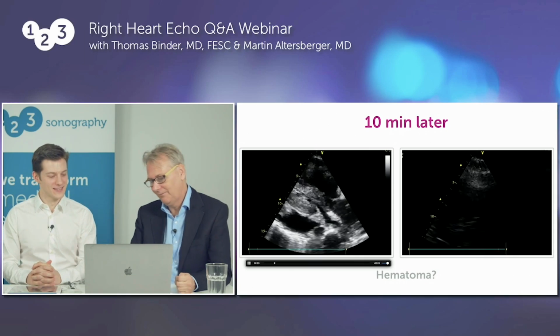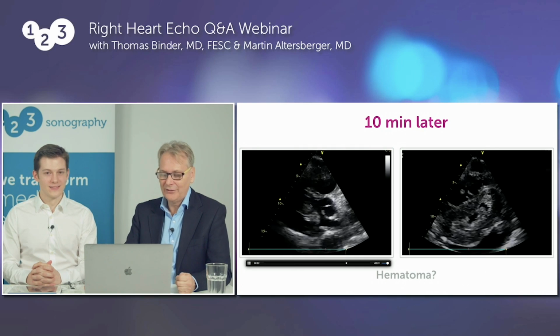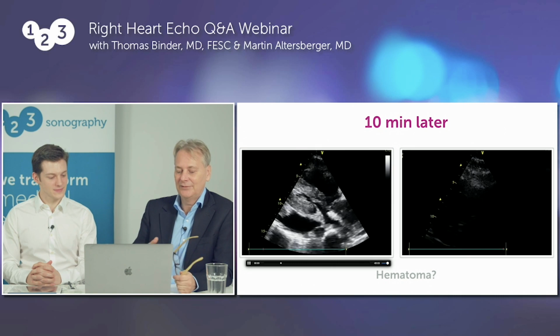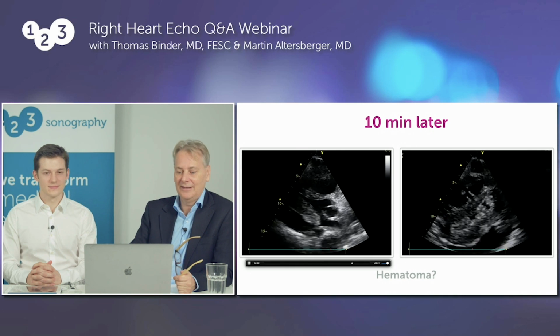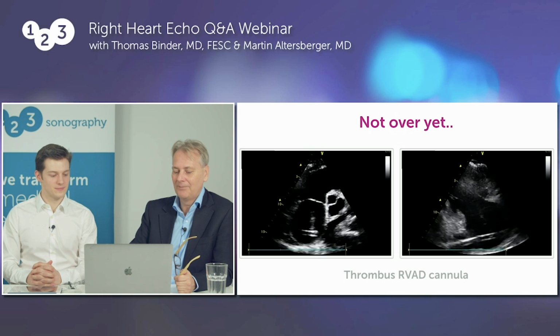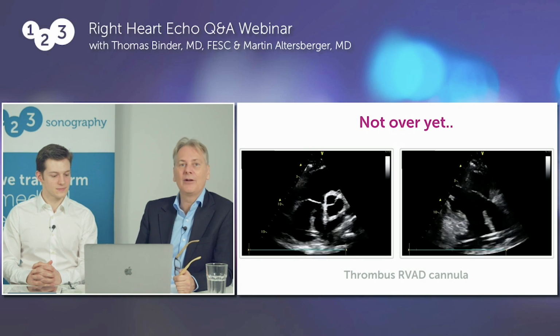Impressive images. Yeah, that's what we thought too, but we were standing there deciding, well, what is it, inside or outside? But we were able to make the diagnosis, and ultimately we brought him to surgery. The hematomas were removed and he recovered, but then we had another problem.